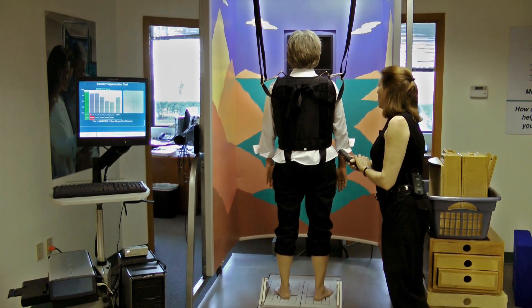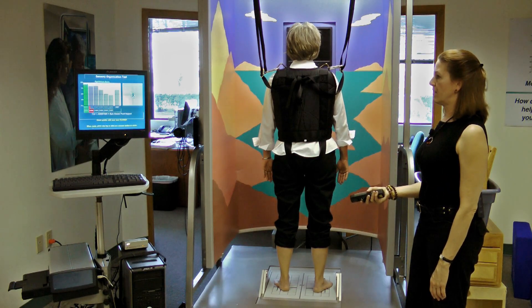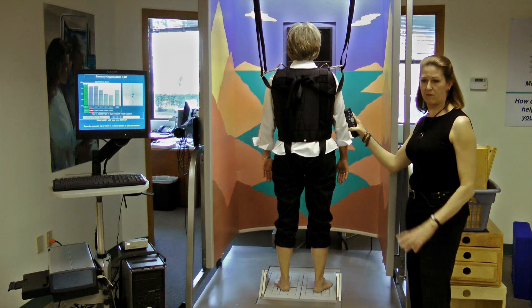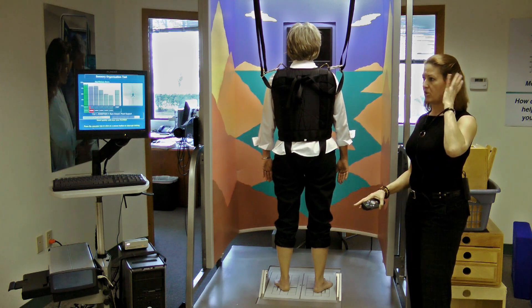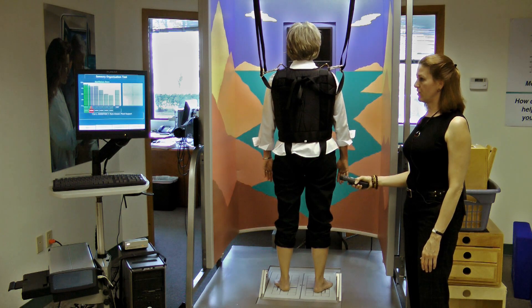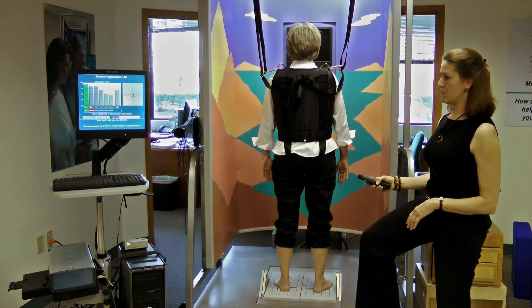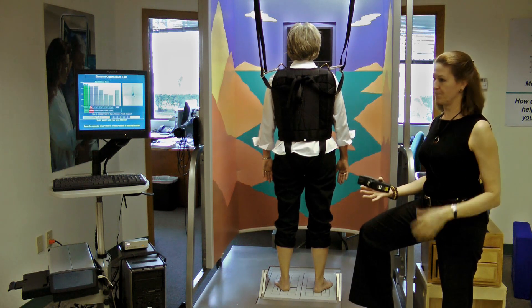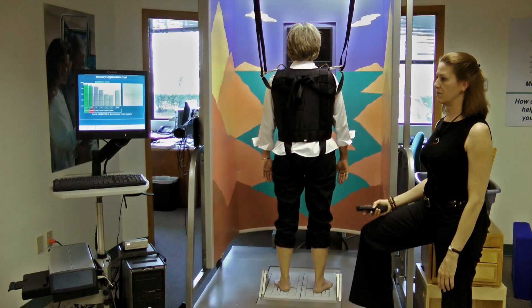Now you get to do the same thing with your eyes closed. I'll tell you when to close your eyes and when it's okay to open them. Close your eyes and testing. Now she's standing on a firm surface with her eyes closed, so we've eliminated vision. She still has the feeling in her feet and ankles to use for postural control and balance, and she still has inner ear function. Normally in this condition, we expect that the nervous system will automatically use the feeling in the foot and ankle for balance, and then vestibular comes in second. So it's expected there's a slight bit more sway, but not very much because somatosensory is still the primary system.